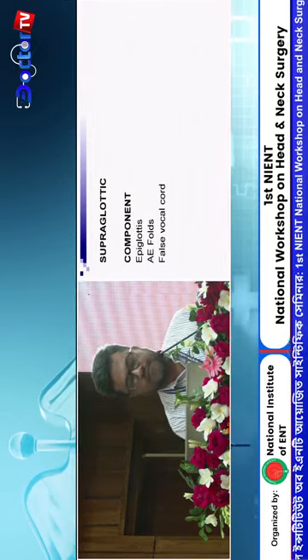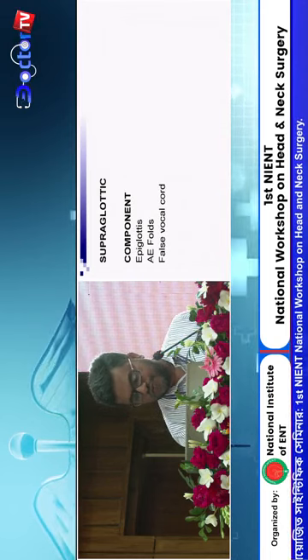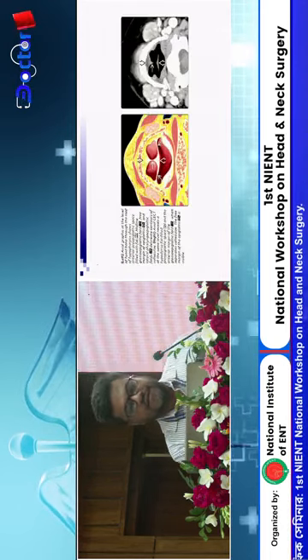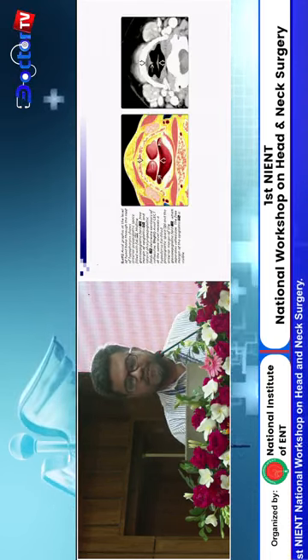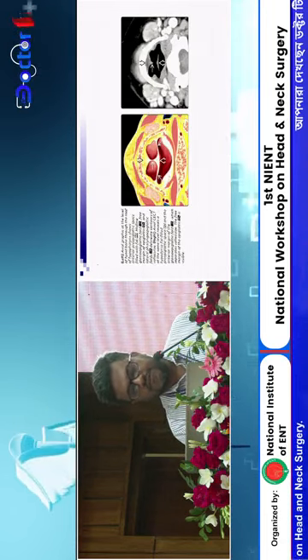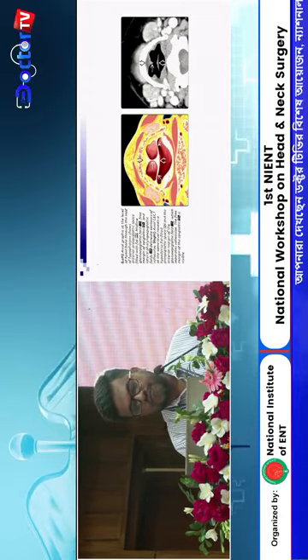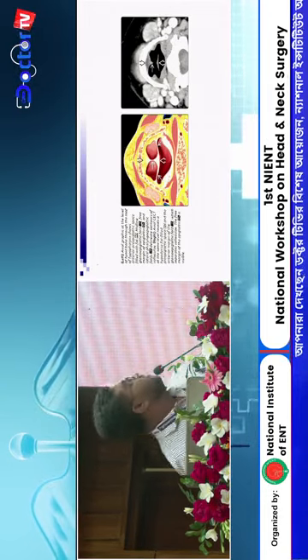The components of the supraglottis are the epiglottis, aryepiglottic folds, and false vocal folds. Here is the graphical representation of the supraglottic area. We see the epiglottis, the median glossoepiglottic fold. These are the valleculae, and same in the CT scan: the epiglottis, median glossoepiglottic fold, pre-epiglottic space.